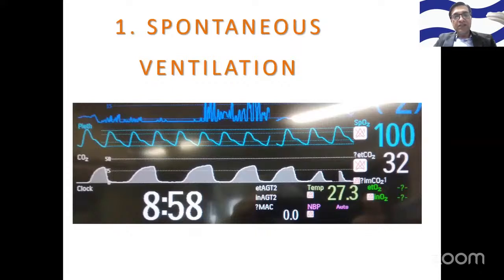There will be some amount of leaking because the patient is just getting under anesthesia, so you may not be able to hold the mask properly. Secondly, as they start getting induced, their respiration becomes jerky. So later on you will see some dips in the EtCO2 height, depending on their ventilation. So with spontaneous ventilation in a non-obese patient, you will get this kind of waveform, not the typical squarish waveform.